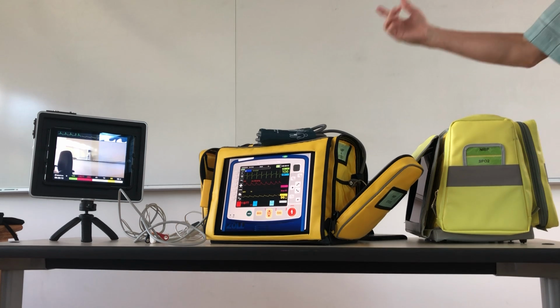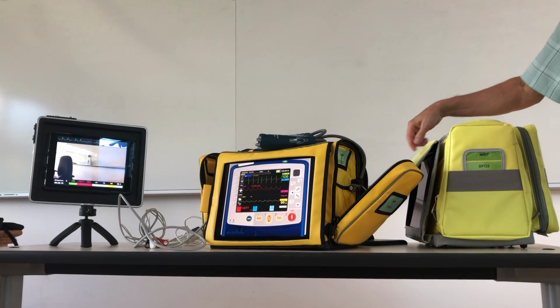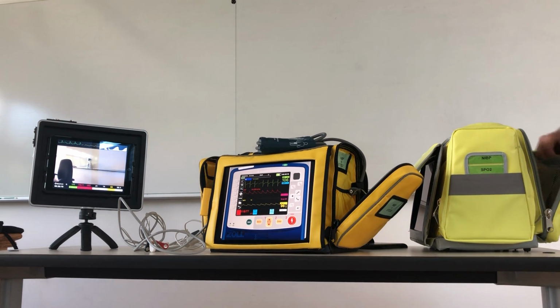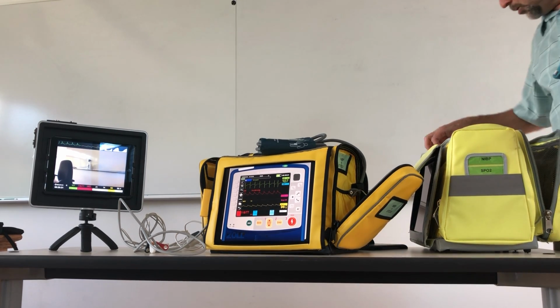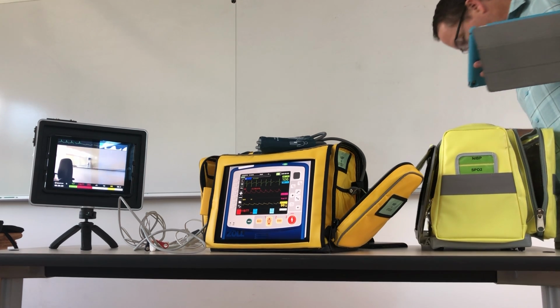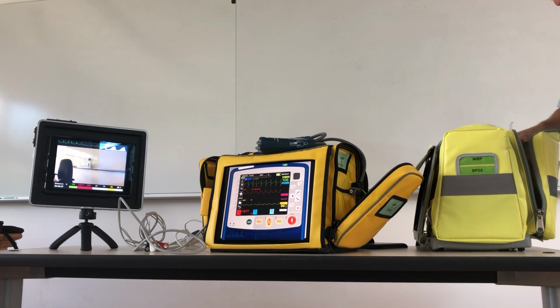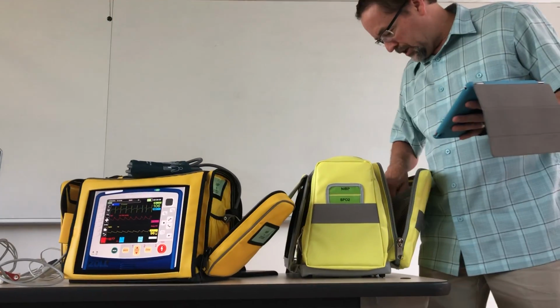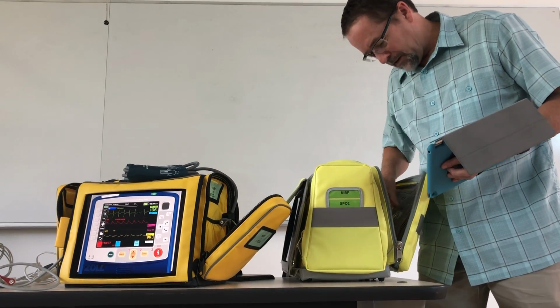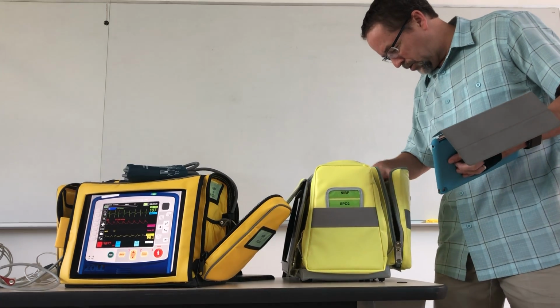But when you pull out the pads, what we do in ours is we use the generic training pads, and the cable that I've got, which somebody took out of my bag. So I've got a 4-lead cable and then the 12-lead to hook into it. I tell you, it's hard to get good help.